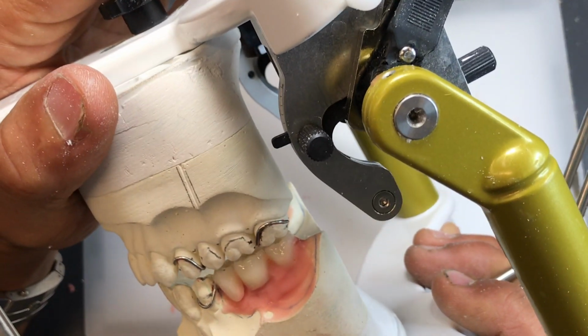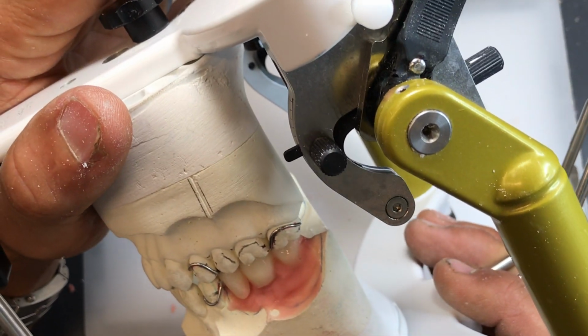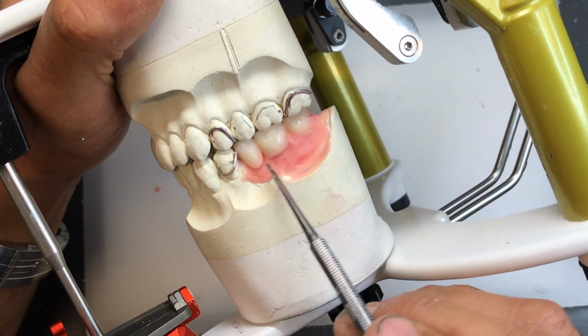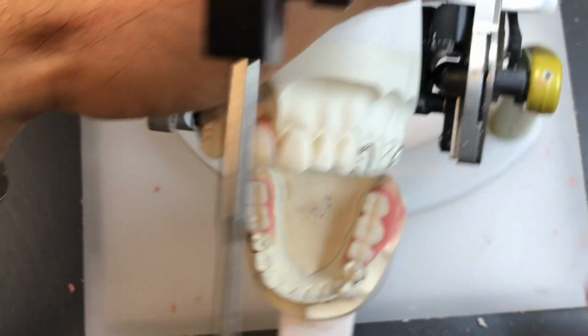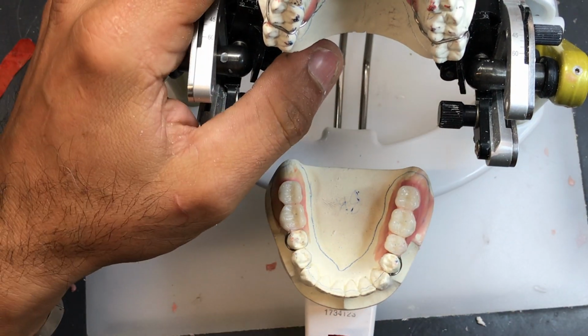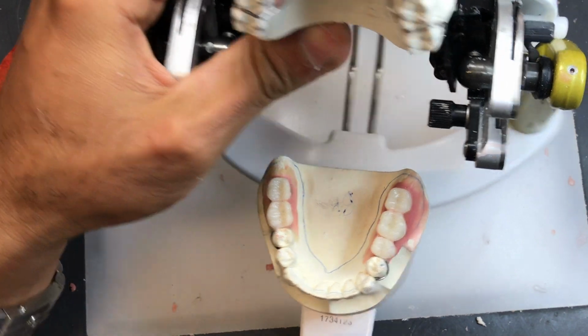Again, I'm not trying to overclose it. I know there's interference back there somewhere, especially around with the second molar. Not so much here. Second molar, so. All right, that looks pretty good.